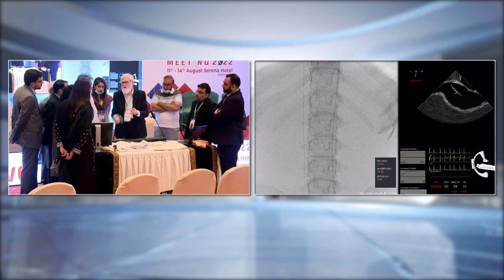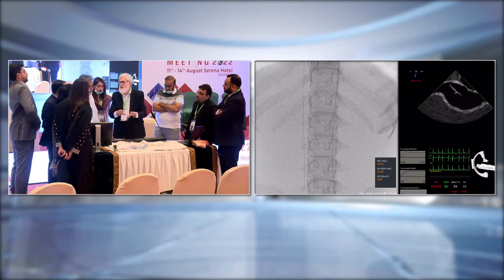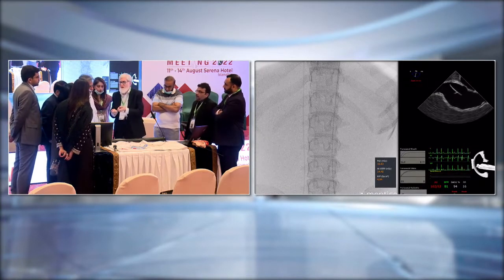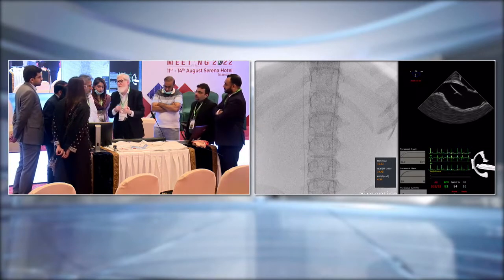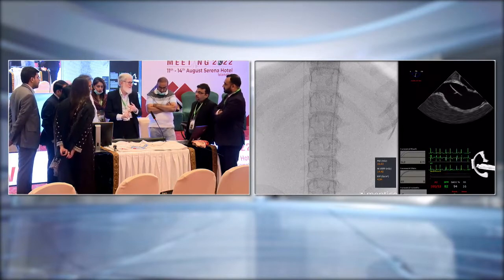Again, in all the tributaries, like the renal veins and others, it will get stuck somewhere. Everywhere it sticks, you pull back on it, do a fluoro. Never go without fluoro if there is resistance. If you go against the resistance, you will create a problem.